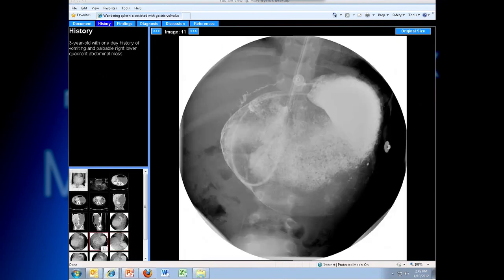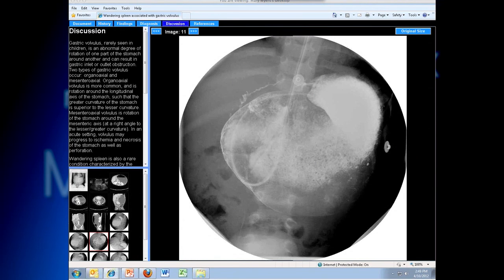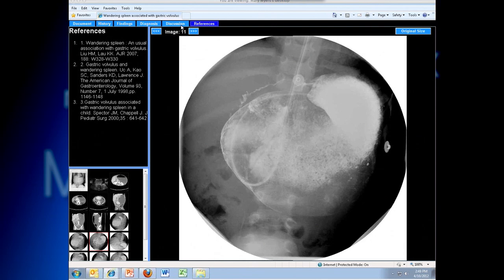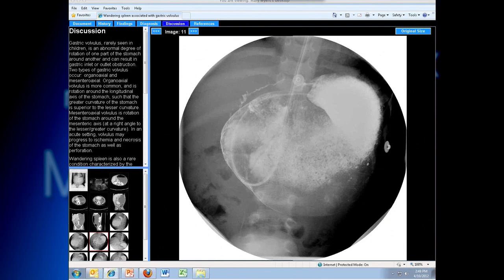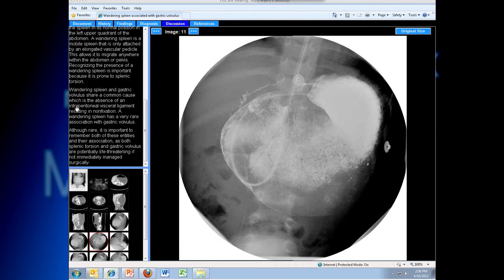This case has a lot of different imaging modalities in it, and we have the standard tabs along the top here for a teaching file — history, findings, diagnosis. We make our residents create a brief discussion, usually a few paragraphs depending on the disease entity, and have some references. Some go into more detail than others, but this is the basic format of all our teaching file cases.